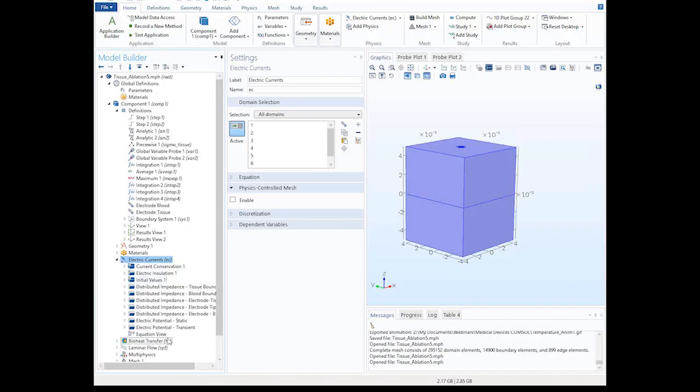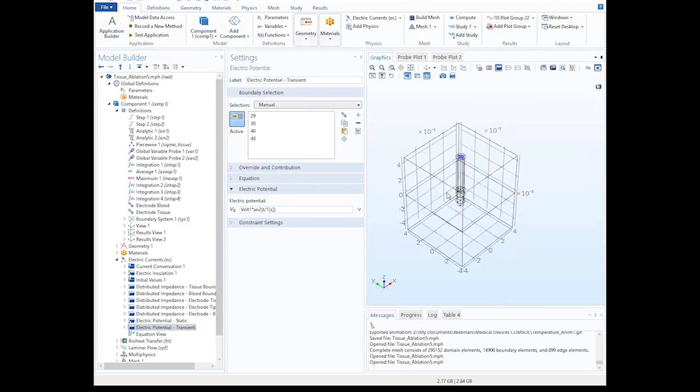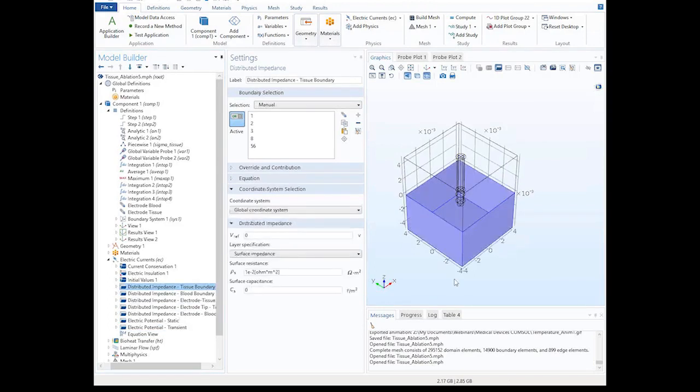There's the voltage applied at this step here, and then there's the impedances. Because this is a single electrode, we have to put proper impedance at the boundaries of the model. I just put a value here, but this has to be checked carefully. There's impedance at the boundary of the tissue, and also impedance at the boundary of the blood.